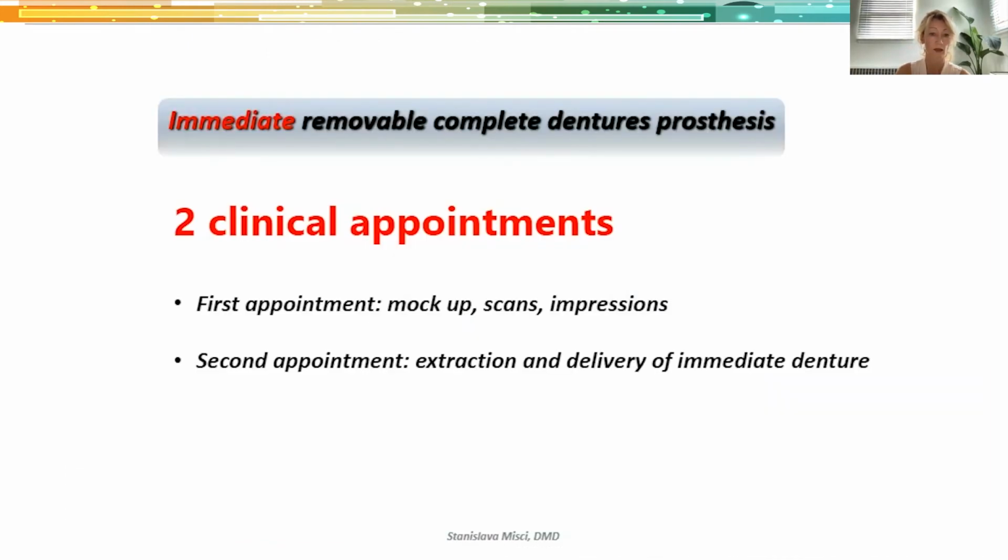So basically, in two clinical appointments, we are able to give the patient immediate dentures. The first appointment is the intraoral mock-up, intraoral scan, and then the impressions. The second appointment is the extractions and delivery of the immediate dentures. We haven't seen the patient for the delivery of the dentures, so she hasn't had the extractions and the delivery yet. But hopefully in the next presentation we will have that.